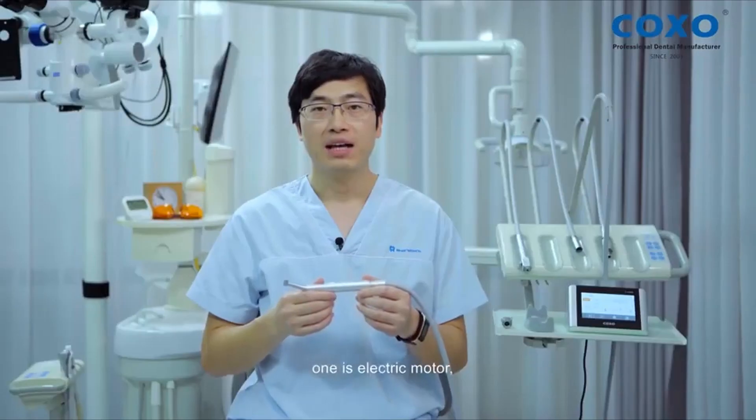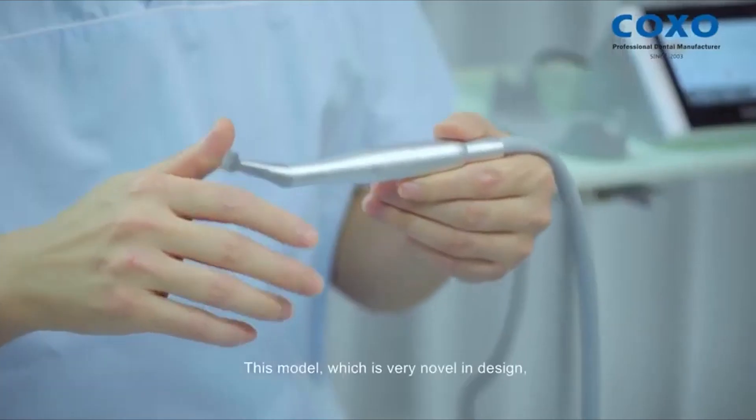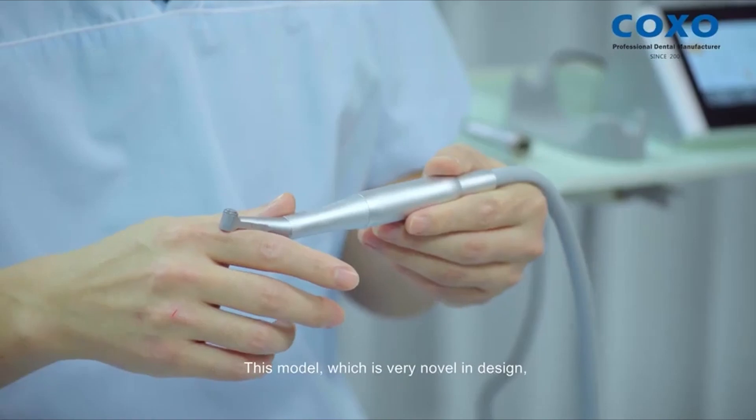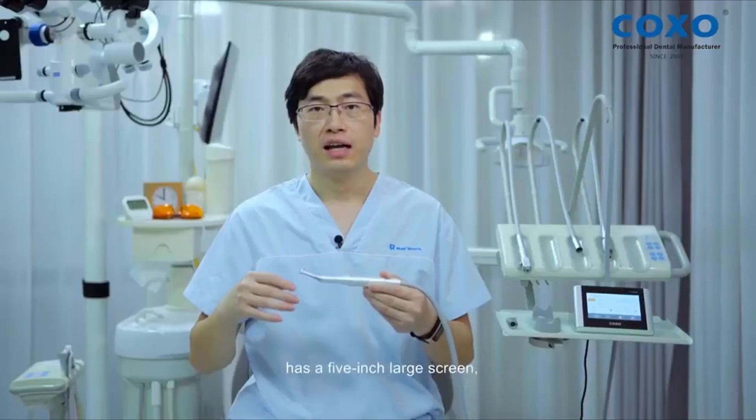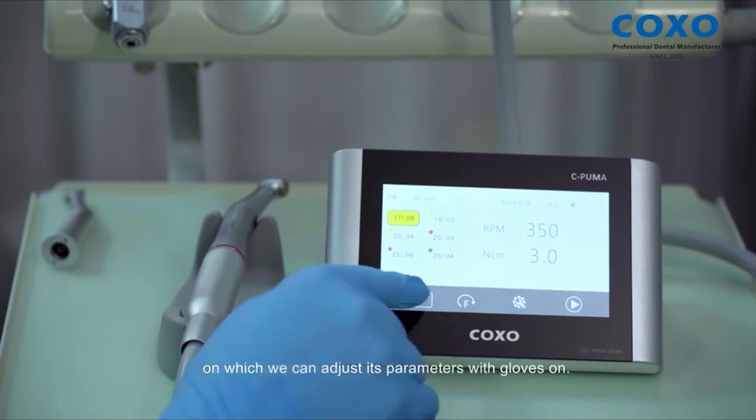It is a two-in-one model and has two functions. One is electric motor, the other is endo motor. This model, which is very novel in design, has a five-inch large screen on which we can adjust its parameters with gloves on.